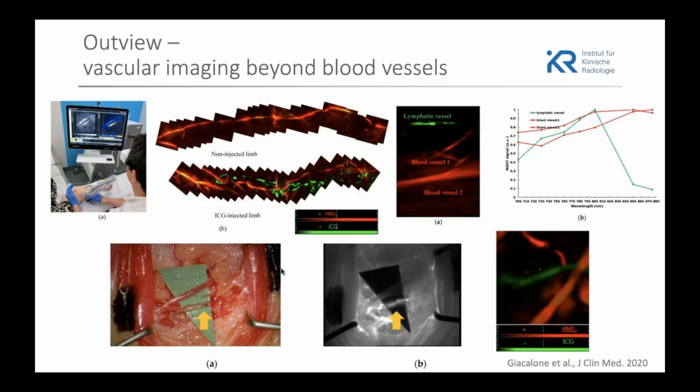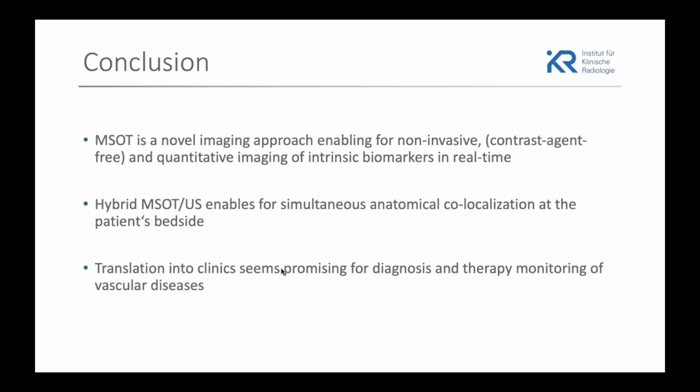So this last paper here, just as an outview beyond the blood vessels, and thus I would like to conclude that MSOT is a novel imaging approach enabling non-invasive and quantitative imaging of the intrinsic biomarkers, which most of the applications at the moment are evaluated in a contrast-free manner.